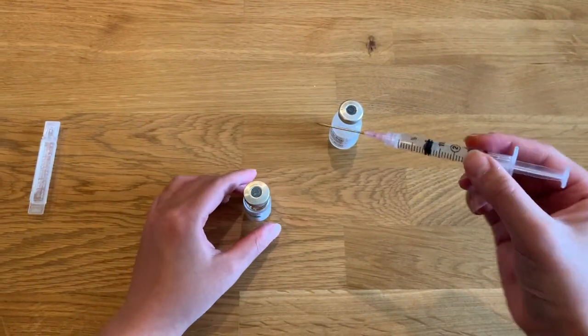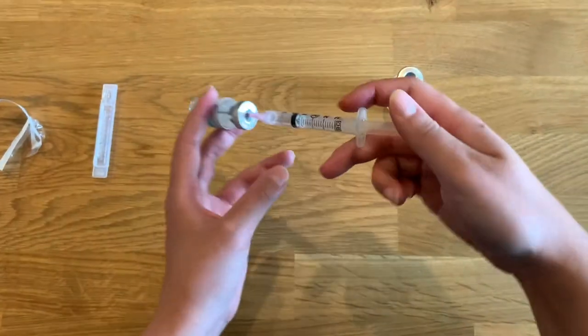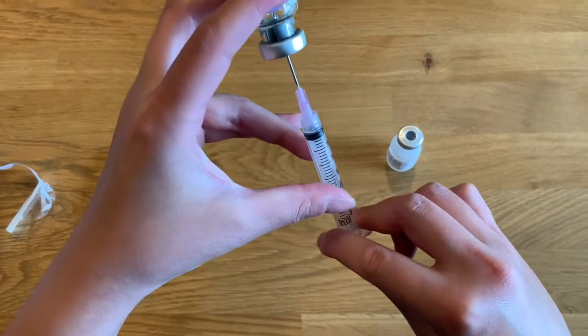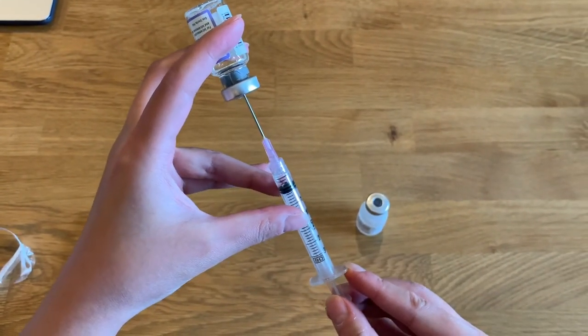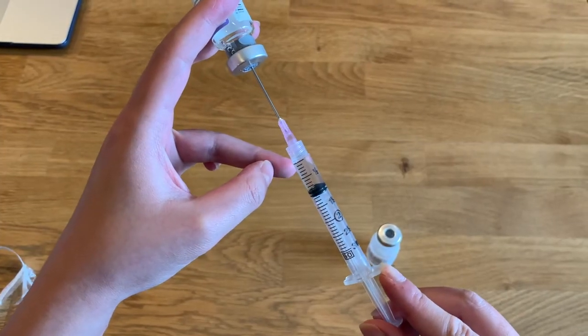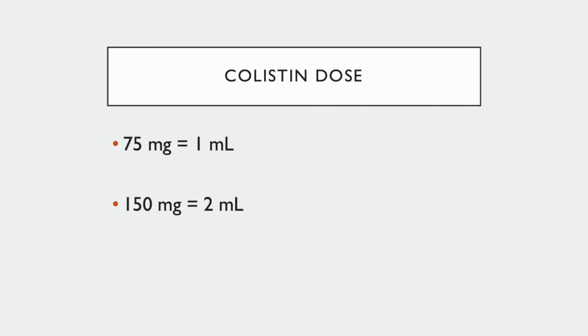Push the needle through the top of the rubber stopper on the colistin vial. Pick up the vial and the syringe, invert them, and push the air into the vial. Draw up 1 or 2 milliliters of the colistin dilution depending on your dose, making sure the top of the plunger is even with the 1 or 2 milliliter mark on your syringe. If your dose is 75 milligrams, draw up 1 milliliter; if your dose is 150 milligrams, draw up 2 milliliters.